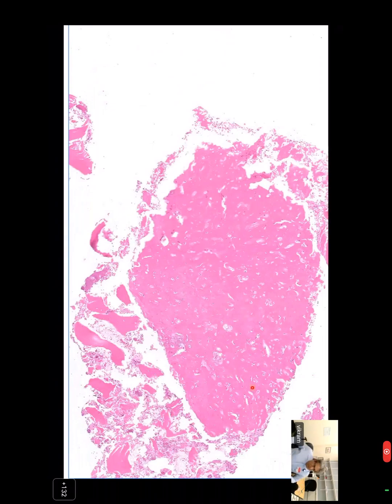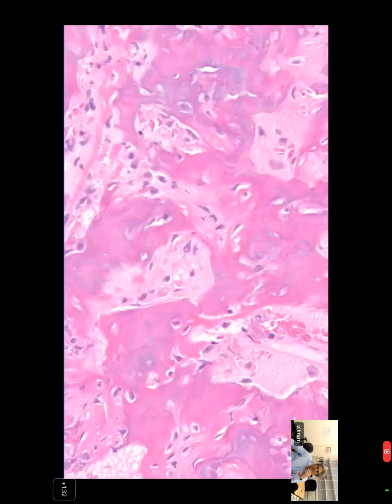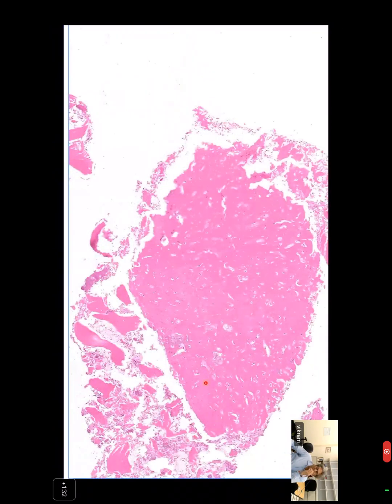Yes, sir. So let me just flip through images, as most people haven't seen these images. Here's the lesion, higher power, very high power, right? So let's see, Gunjan, why don't you talk us through this?